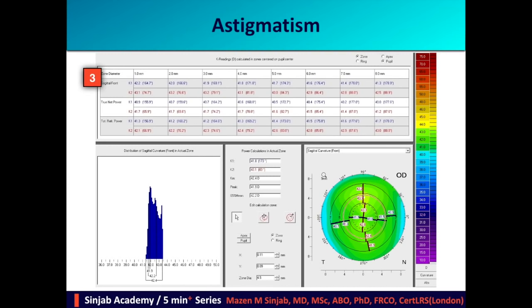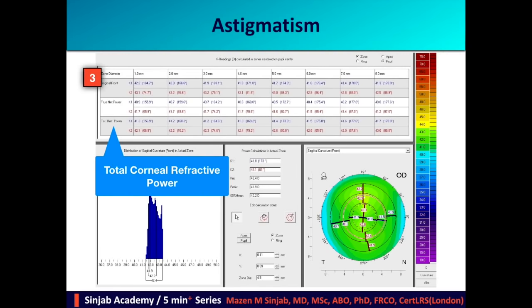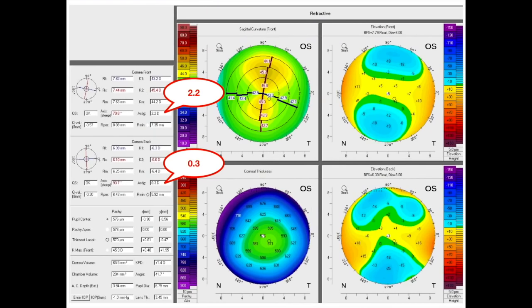The third point is astigmatism. We have to study the topographical astigmatism based on the total corneal refractive power in the 5 mm zone centered with the pupil center. When we don't have access to this map, we can roughly calculate the amount of corneal astigmatism by deducting the astigmatism of the posterior surface from the astigmatism of the anterior surface.